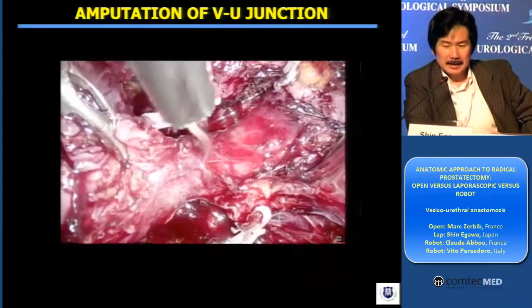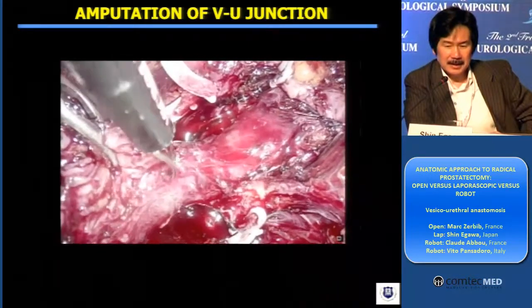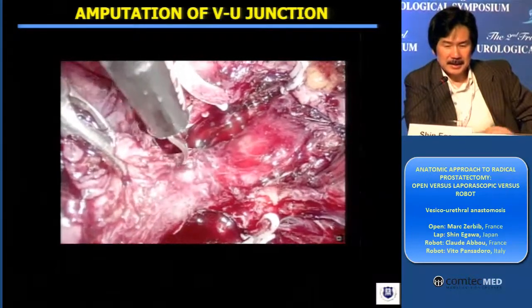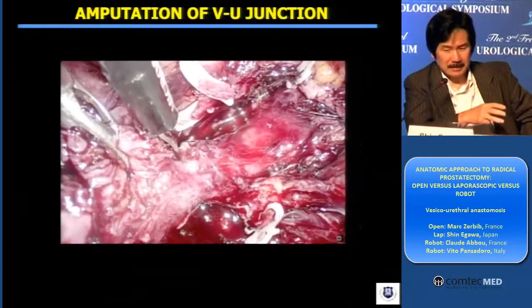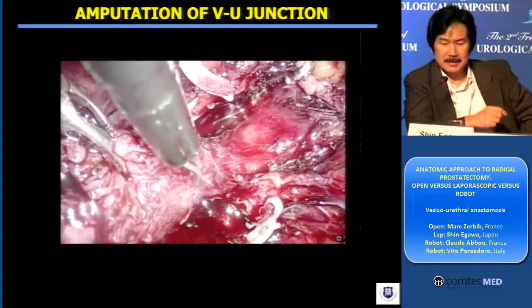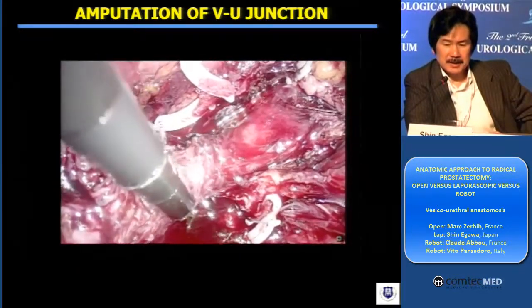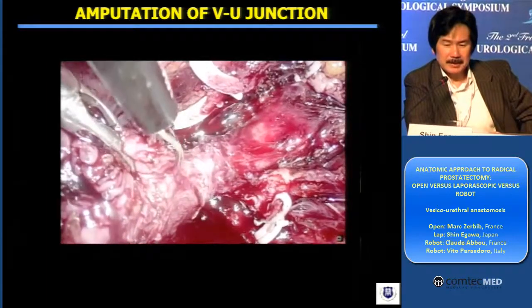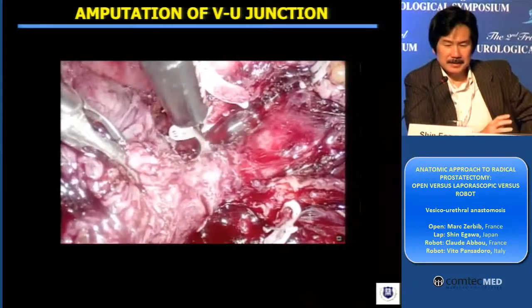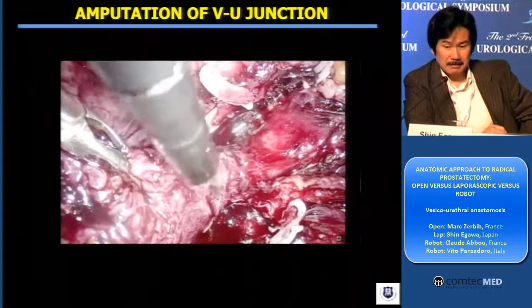Another case here. What you see here is I'm dissecting the circular part of the inner muscle sphincteric layer — smooth muscle layers — at the level of the junction. And gently revealing, developing the plane to reveal the longitudinal muscle sphincteric smooth muscle layers.